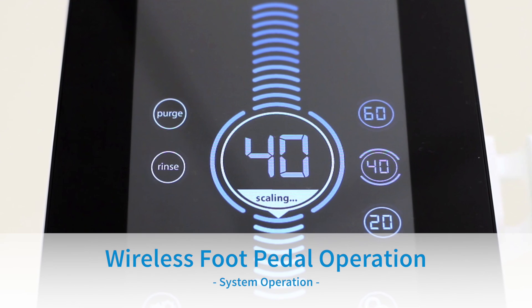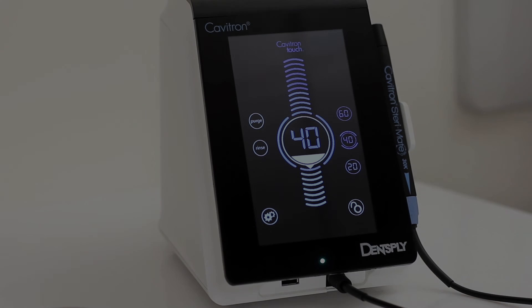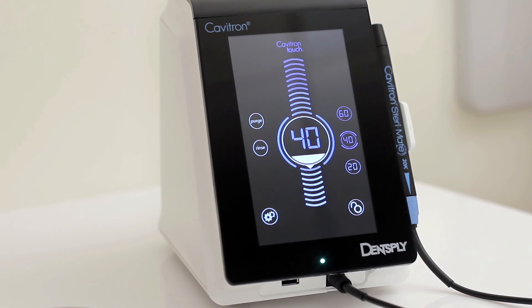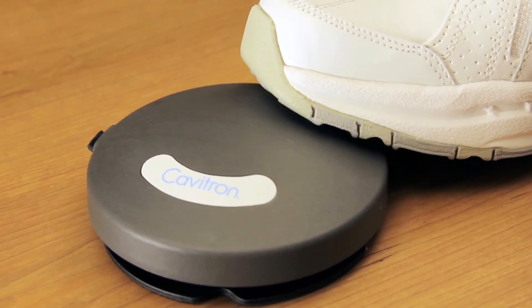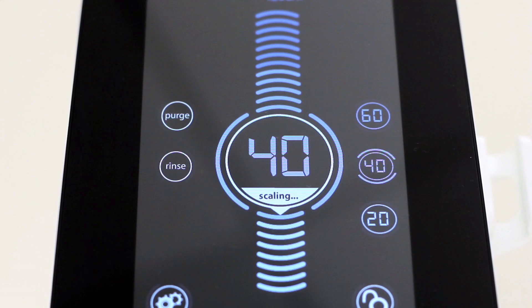Tap-on wireless rechargeable foot pedal operation. This feature eliminates the need to hold down or pump the foot pedal, adding comfort to your routine. Enter the settings screen to enable or disable tap-on. When parentheses are shown around the tap-on icon, tap-on is activated. If there are no parentheses visible, tap-on is deactivated and the icon will be grayed out. With tap-on activated, tapping on the foot pedal once will activate ultrasonic power for approximately 4 minutes. Tapping the foot pedal a second time will disable ultrasonic power and water flow. On the main scaling screen, a tap-on indicator will appear in the power level bubble while scaling.